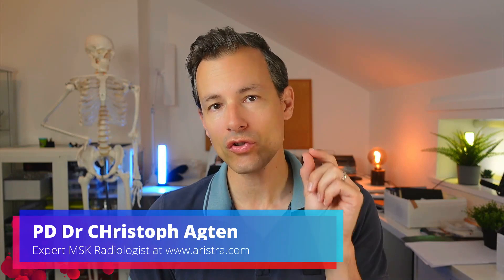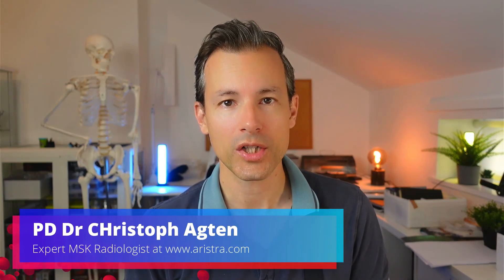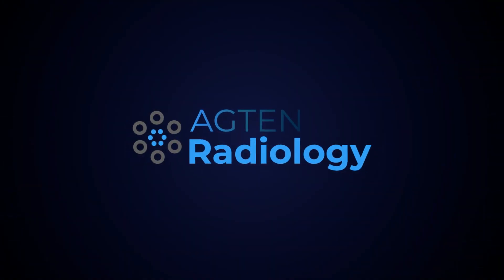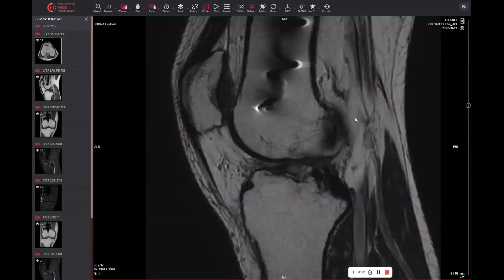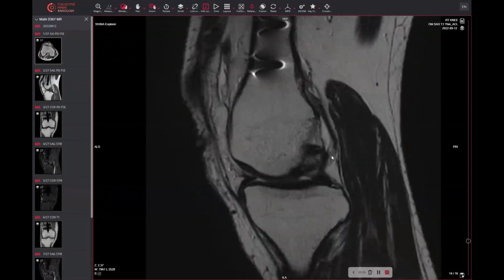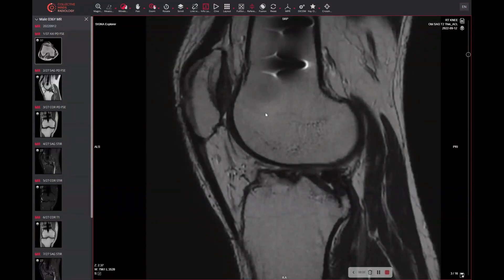In today's video we have a look at the patella on MRI and we look at a specific structure in the patella that you should not mistake for pathology. So let's have a look. Here we have a knee MRI and we want to focus on the patella.